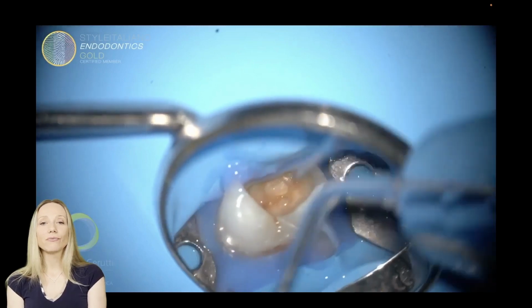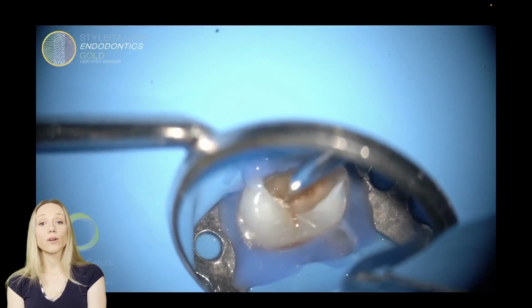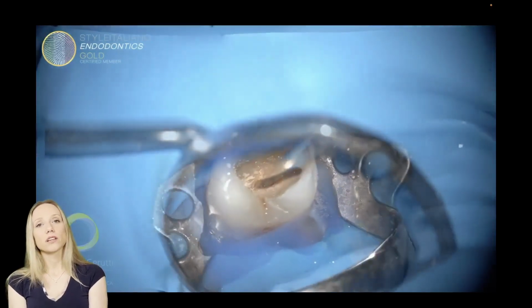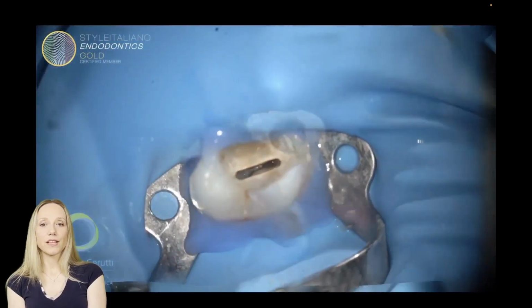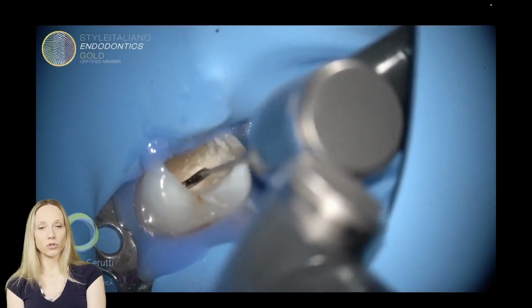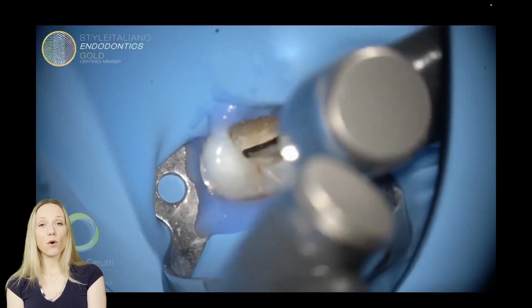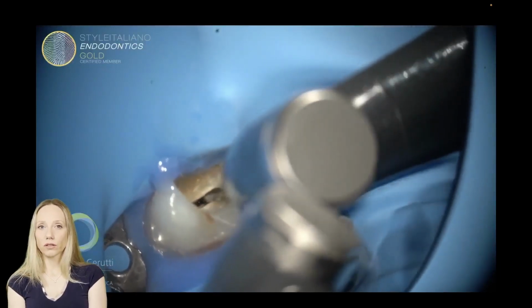And here is a completely different case. So we have a premolar, we have already removed the decay, so we have an outline of our access cavity. This was a caries-driven access, but we always have to remember that the instrument might have a straight line access to the root canal. We do not want to have coronal interferences because, first of all, our instruments work better and are more performing if we do not have coronal interferences.